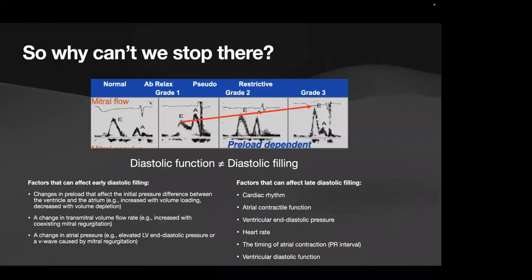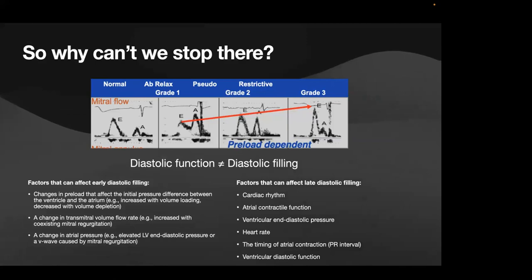And so many of you astute who are still awake at 8:15 will wonder, well, why do we care? Why can't we just use those parameters that I just talked about to give us a sense of what diastolic function is? Well, diastolic function and diastolic filling are not entirely the same thing. There are a lot of things that can affect your diastolic filling, and it's a bit of a challenge to tease out the differences between the two and how we can get to the sense of what the filling pressure is, what the diastolic function is, and how we marry those two concepts together.